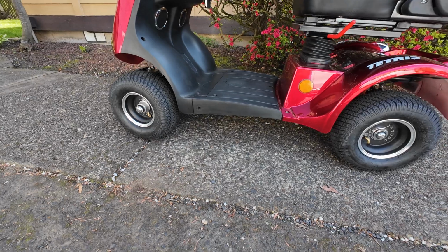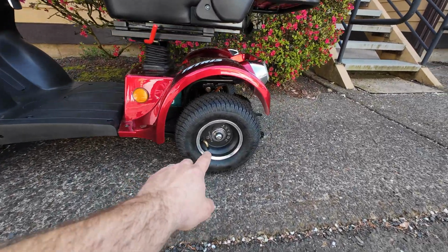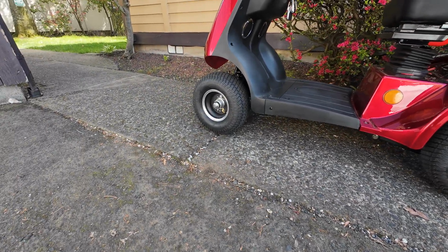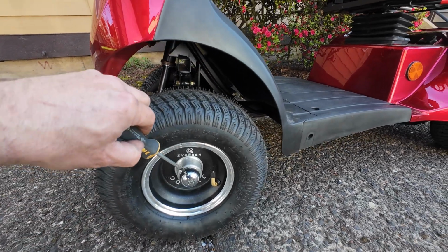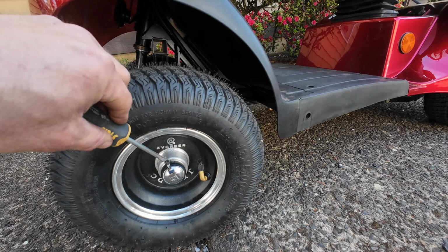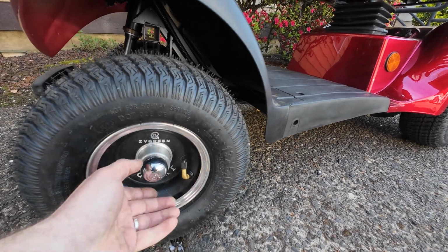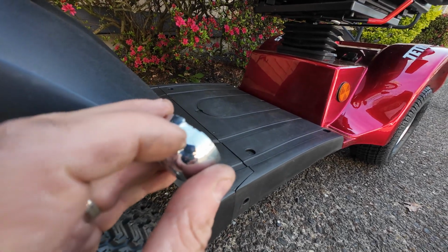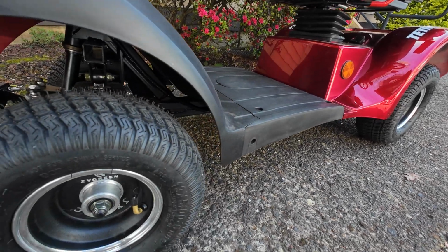Now the next step would be removing the plastic cover caps in the middle, because behind those caps you will have the actual nuts that hold in those wheels. So you will need a flat screwdriver, and look for the spot all around this cap so you can pry it out. There is a special notch made on this plastic cap for that flat screwdriver.